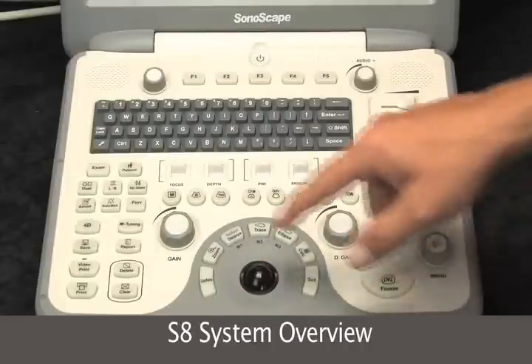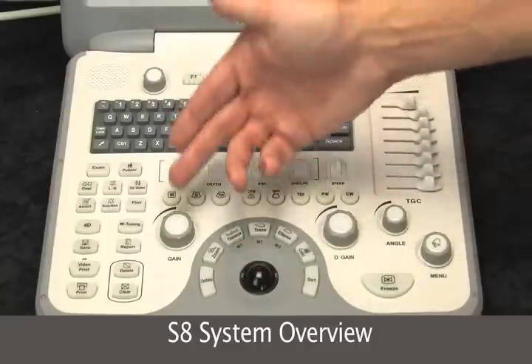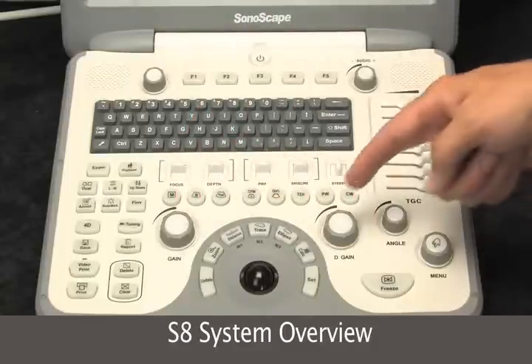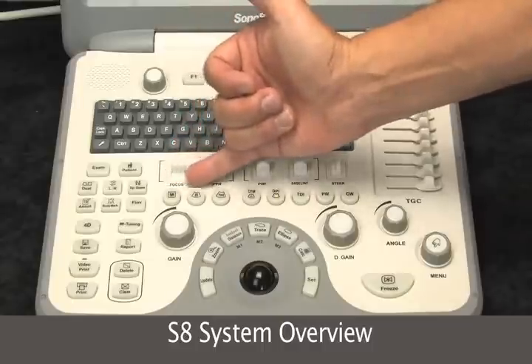The trackball and the set key are the ones you'll use the most. Then you have your update, zoom, and calculation buttons up here — your measurement and calculations. B-mode gain and Doppler gain are very close to the trackball.